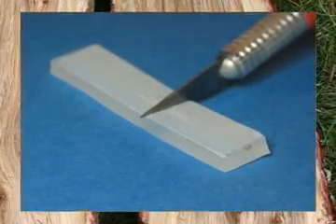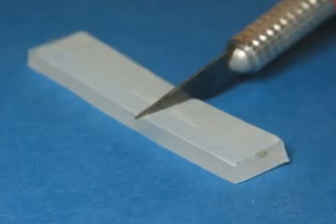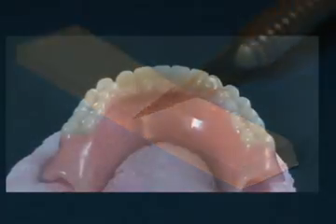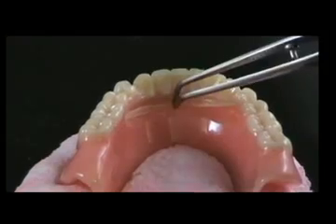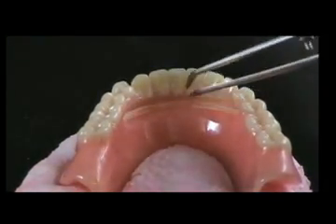Cut the proper length of E-fiber in the clear silicone packaging with a sharp knife or scissors. Remove the impregnated fiber from the clear silicone packaging and use a hand instrument to adapt it to the size and shape of the lingual groove.